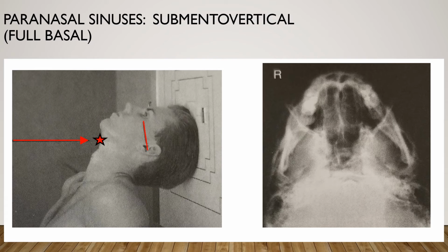We're going to adjust the head to rest the infraorbital meatal line as near parallel to the plane of the image receptor. We're going to ensure no rotation or tilt, and we're going to center the image receptor to the central ray. Central ray is going to be horizontal and perpendicular to the infraorbital meatal line, centered to the midpoint between the angles of the mandible, and you're going to be at least 1.5 to 2 inches inferior to the mandibular symphysis.